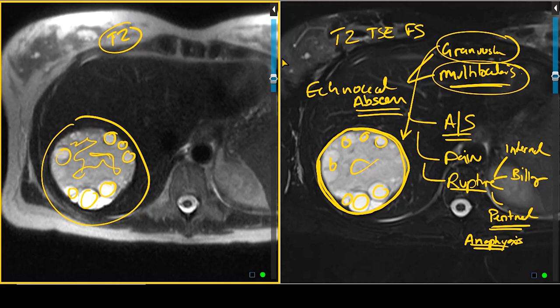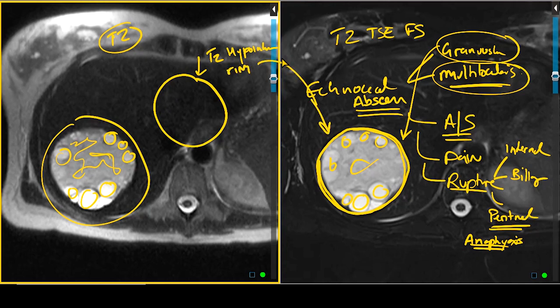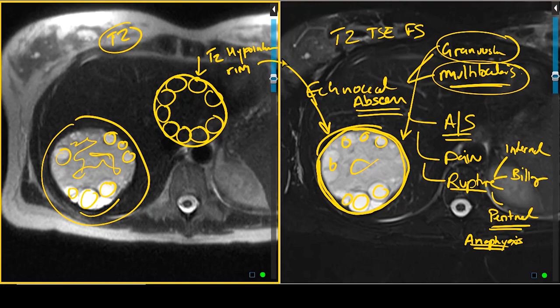The imaging appearance is quite characteristic. You will have a dominant cystic mass with a very discrete T2-hypointense rim, as can be seen on the fat-saturated image. At the periphery of this, you are going to see multiple daughter cysts. That is what we are seeing along the periphery of this mass, and this finding is characteristic of an echinococcal abscess.